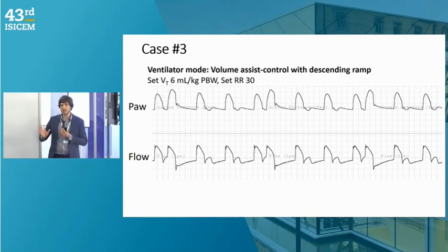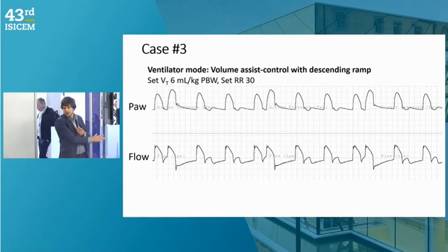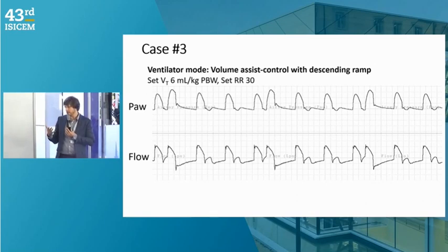But it's because that PEEP is mostly just pushing against the chest wall that it would be safe. If you or I had a PEEP of 24, we would probably arrest right away. So it's context dependent. And as I mentioned in an earlier talk, if you inherit that patient on your ICU service and they're at a PEEP of 5, it's very important not to just immediately turn the PEEP all the way up. You would want to do it stepwise because you don't know hemodynamically necessarily how they're going to respond.